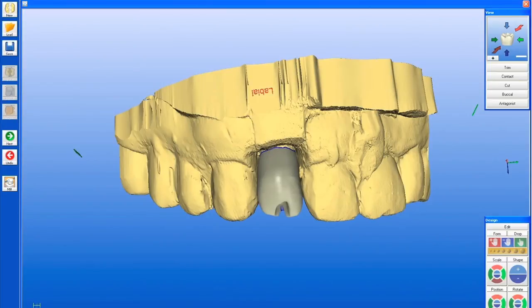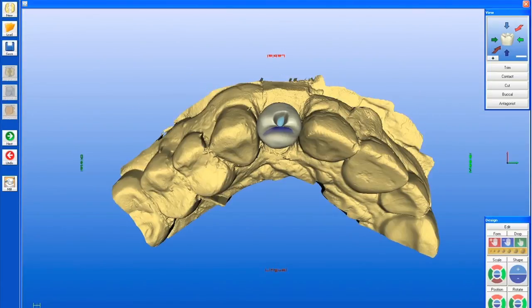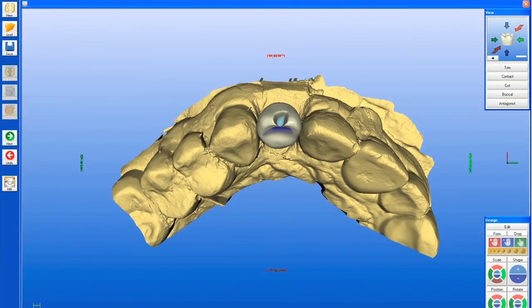Here on the incisal edge, I've used the shape tool and created a divot into the restoration that will give me access to my screw hole, allowing me to create a screw-retained implant restoration temporary. Here's our design completed, and at this point we're ready to go ahead and mill out our restoration.